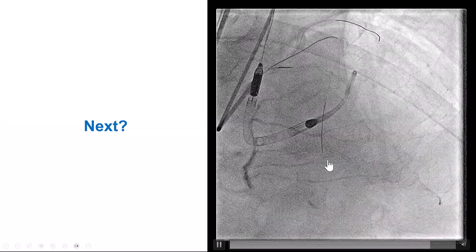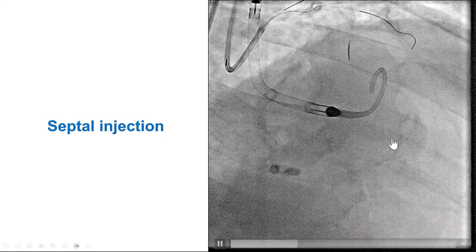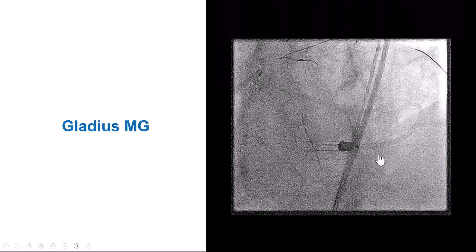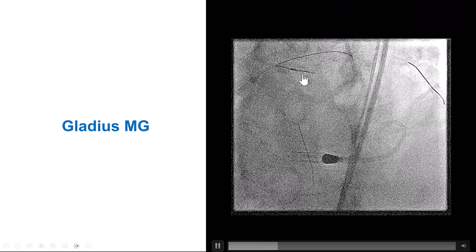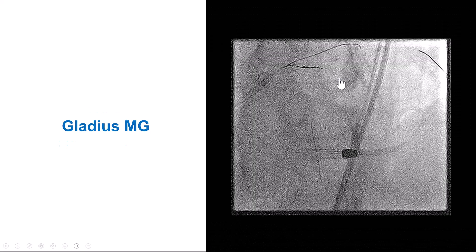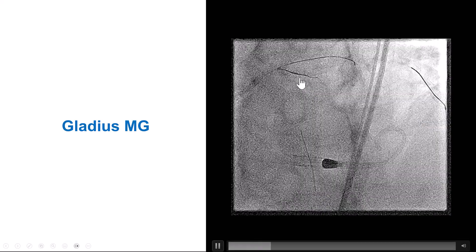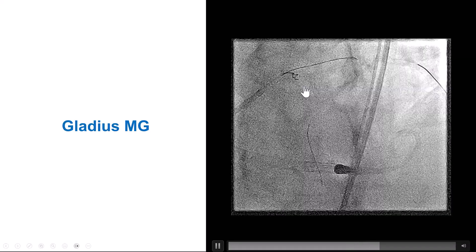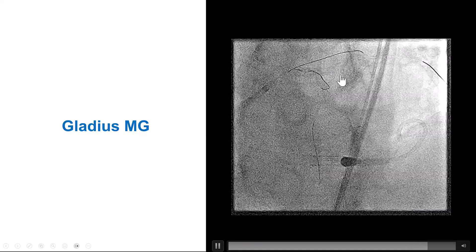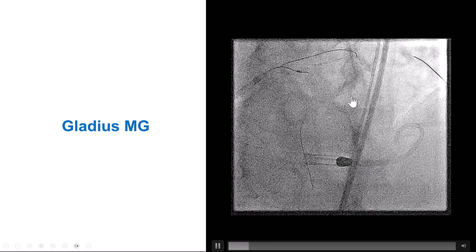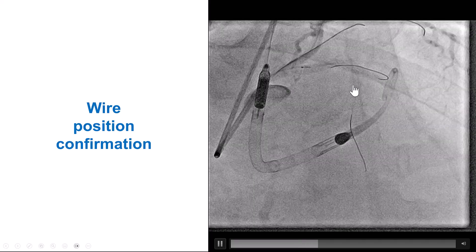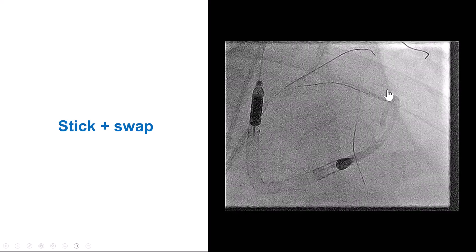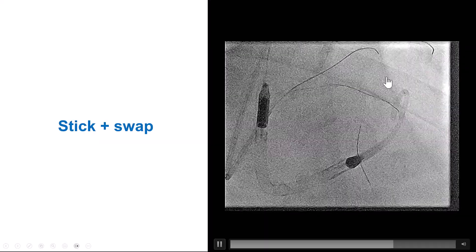We knew we were in a septal and briefly tried retrograde on the right, changing our original plan. However, surfing did not work, and contrast injection showed a fairly faint and tortuous connection. We stopped that attempt, left the wire in, and decided to try knuckling and subintimal re-entry. Using another Gladius MG wire through a dual-lumen Sasuke microcatheter, we tried to knuckle the wire; it initially kept going into the septal branch, but eventually seemed to track a little further down the vessel. An injection confirmed we were in an extravascular space in the mid LAD.